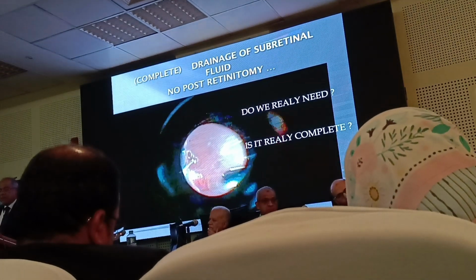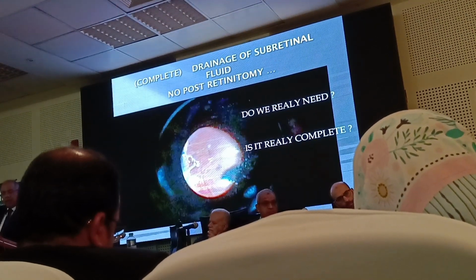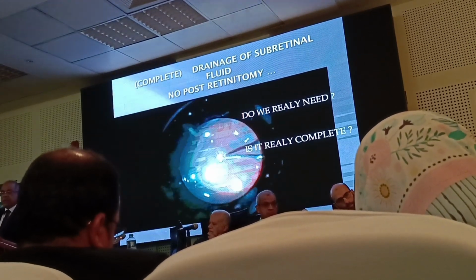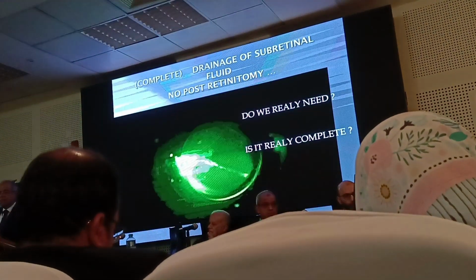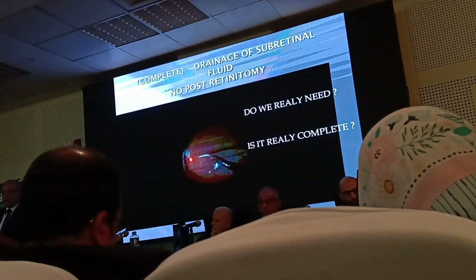So air is going to fill the eye from the opposite side, pushing fluid and perfluorocarbon in front of the retina posteriorly, and maintain drainage in the periphery till the retina is almost dry. Actually, there is no such thing as complete dryness of the retina. There is always a thin film of subretinal fluid.